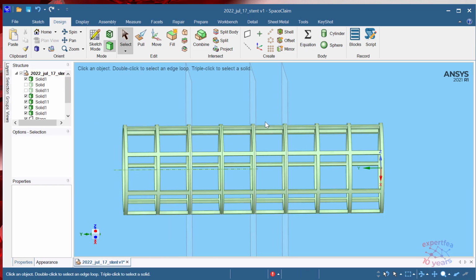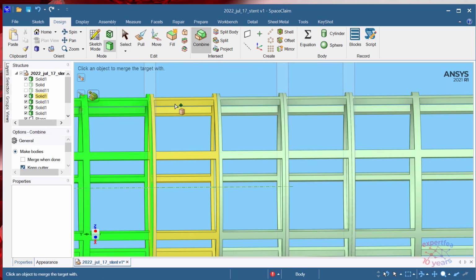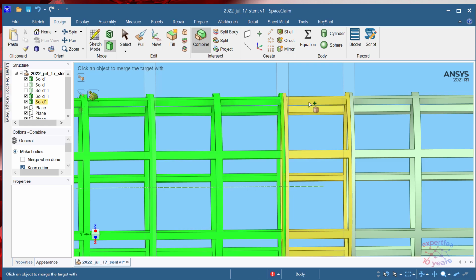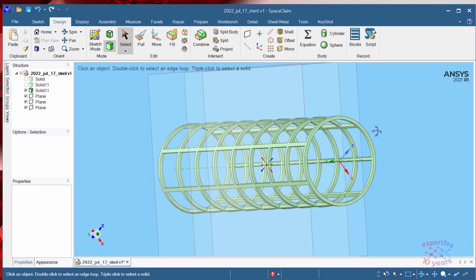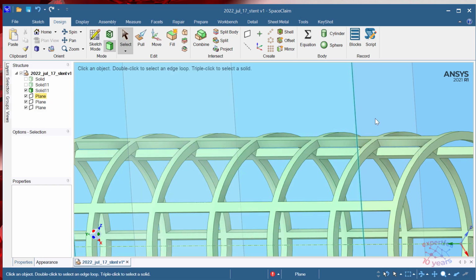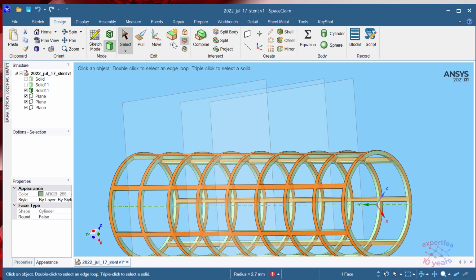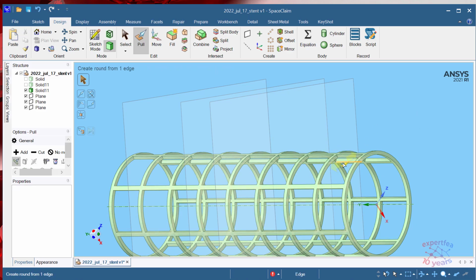And now let's unite everything because we have several separate parts. Combine this part with this part, Ctrl pressed, with this part, with this part, with this part. Yes, now we have a nice stent. Only what we will need to do is that the outer face, let's decrease its diameter a little more. So instead of having 2.7, let's have 2.68, in order to decrease the gap between the stent and the plaque.